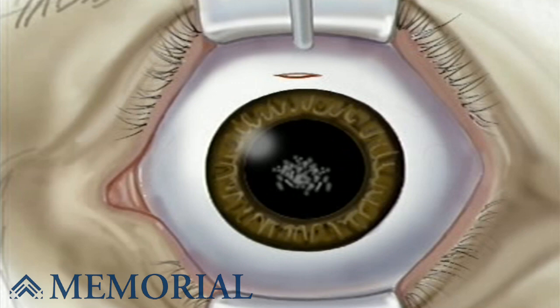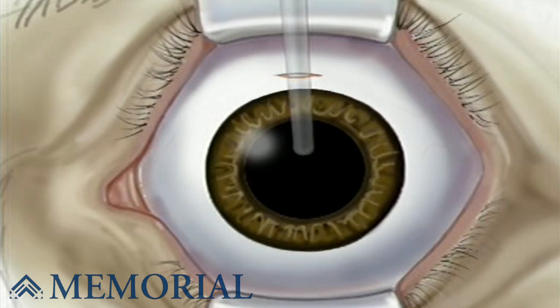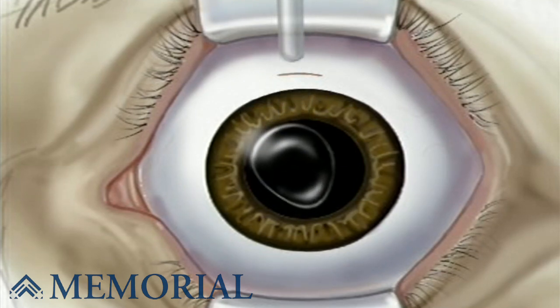The microscopic pieces are then drawn out with gentle suction through the small incision. The surgeon will then insert the new lens, which is actually rolled up inside a special injector designed to fit through the small incision made above the iris.